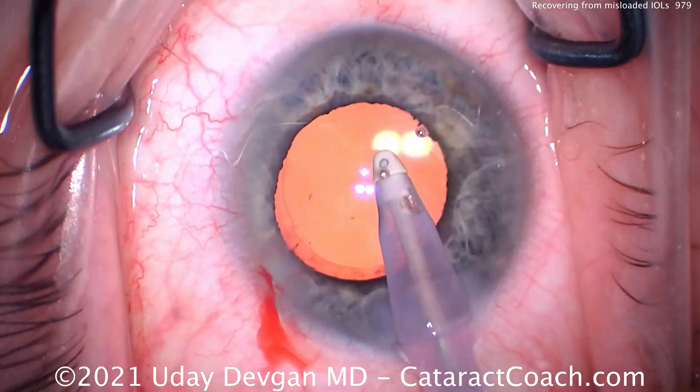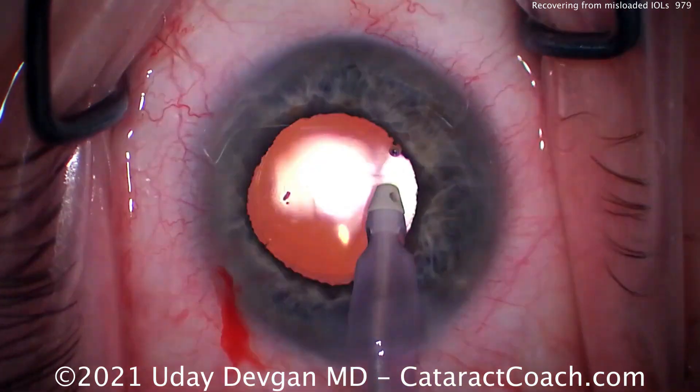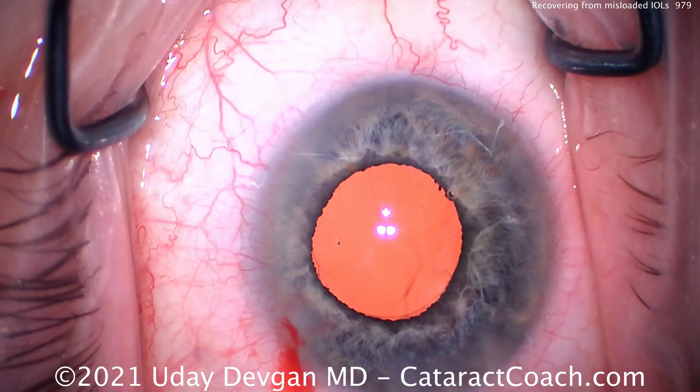This looks great. We'll finish up the case here. You can see the case is otherwise totally normal. The patient had a beautiful visual outcome with no deleterious effects. So that looks great. I'm going to seal up the incision. Let's go to the next case.